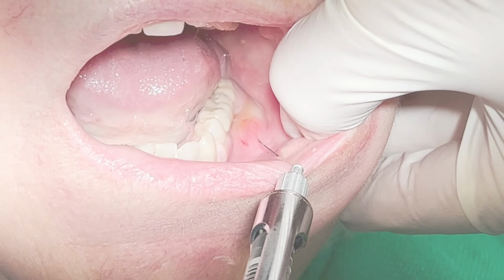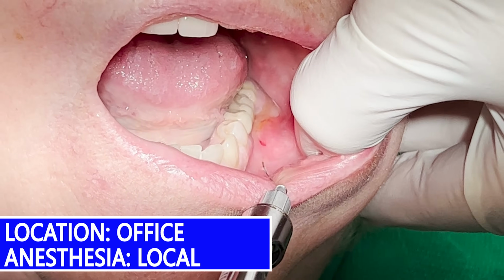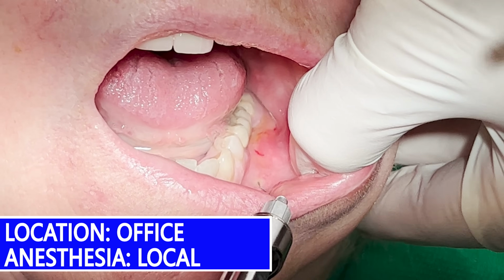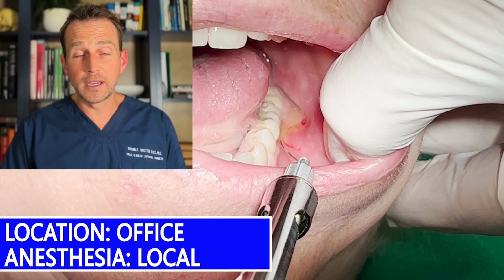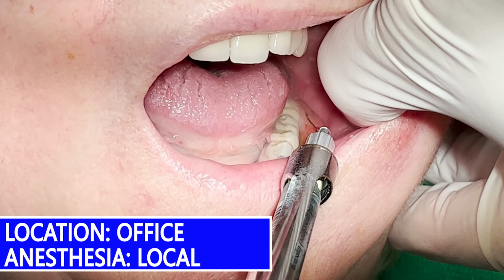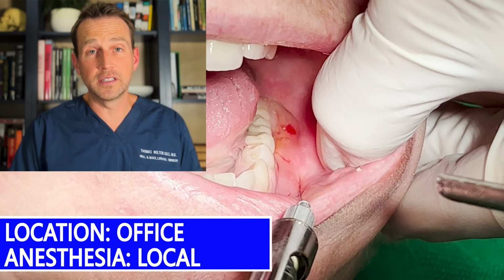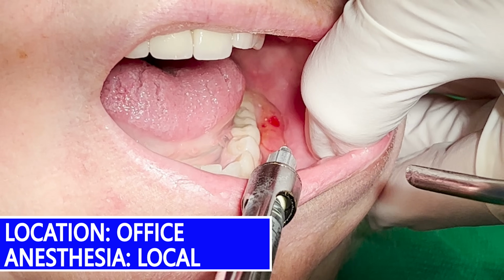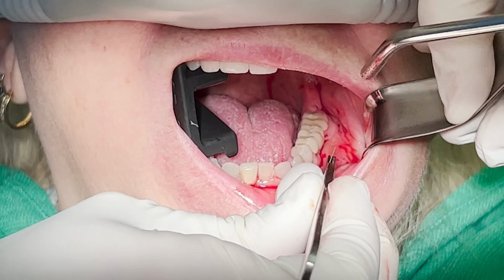This can be done under local anesthesia, although it can be very hard to anesthetize an area with an active infection. The first step is to administer an inferior alveolar nerve block and then give local infiltration as well. I start superficially with the local and then eventually enter the abscess cavity. I allow plenty of time for the local to work.